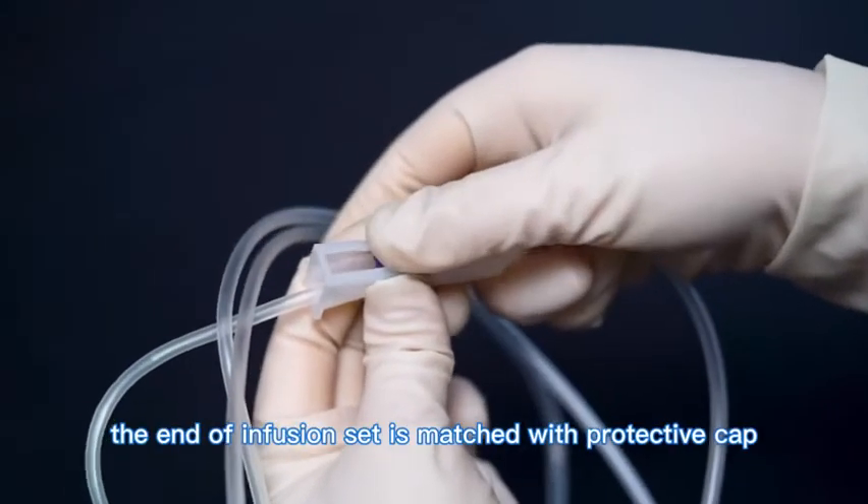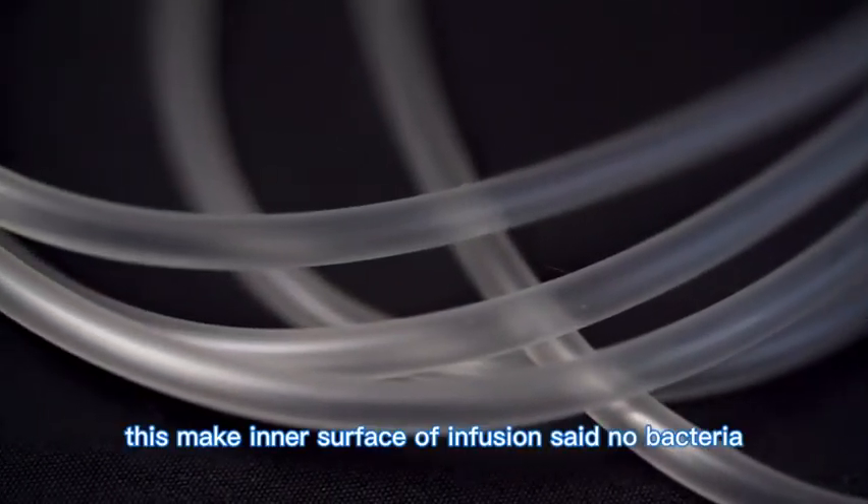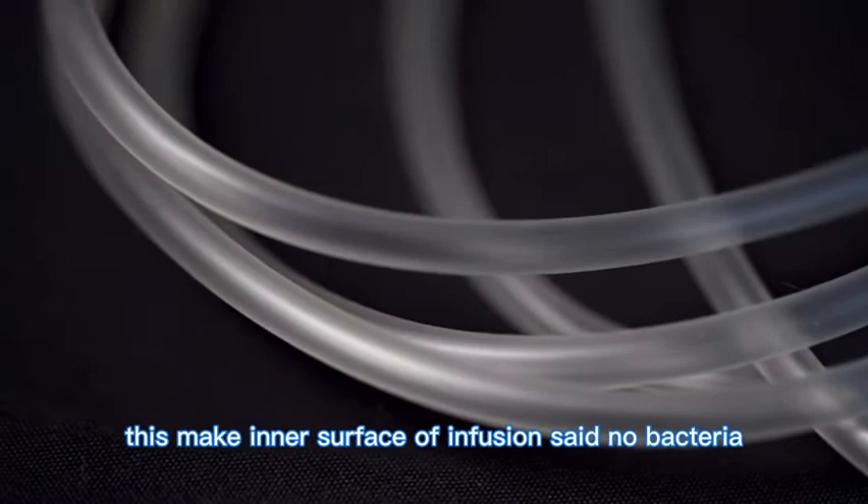5. The end of the infusion set is matched with a protective cap that cannot fall off naturally, making it convenient in use. This keeps the inner surface of the infusion set bacteria-free.